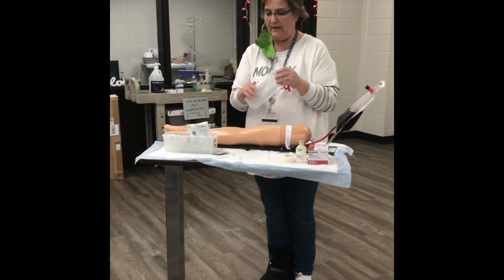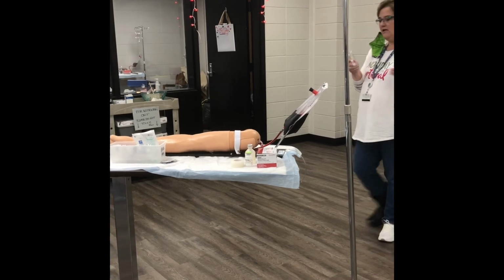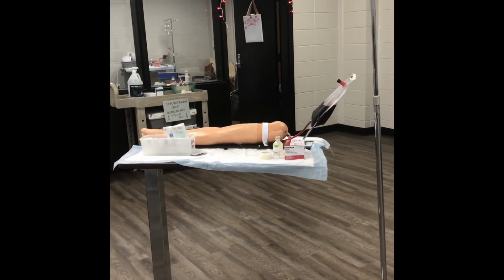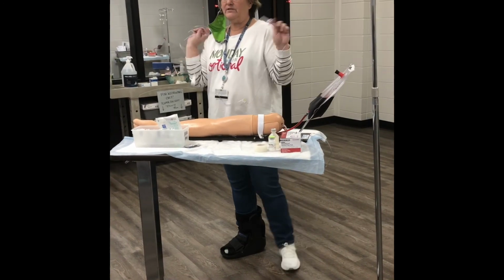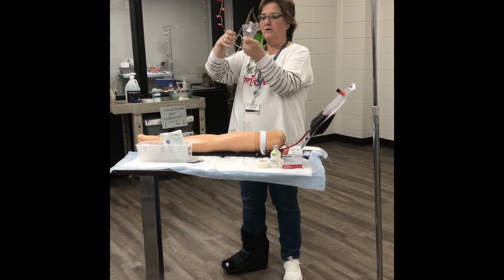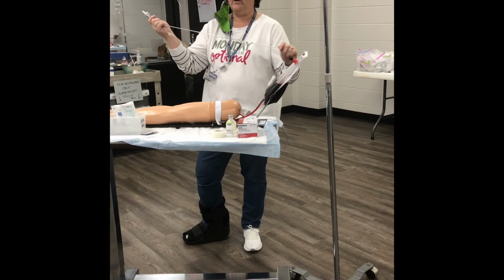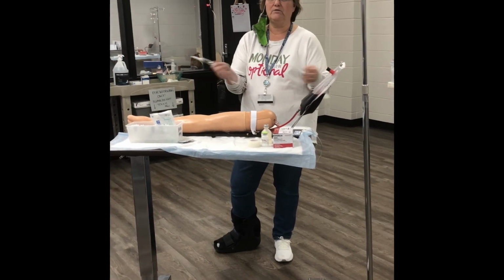You can go ahead and spike the bag, take your tubing. When you open IV tubing, first thing you need to do is close it. Roll the clamp down. Open the tubing, roll the clamp down. The reason being, especially in a competency when you're nervous, if you forget to roll the clamp down and you spike the bag with this, you're going to get air from here all the way to here, bubbles, pieces of air. You won't fail, but you have to spend 10 minutes trying to get all the air out before you can actually go and start your IVs.